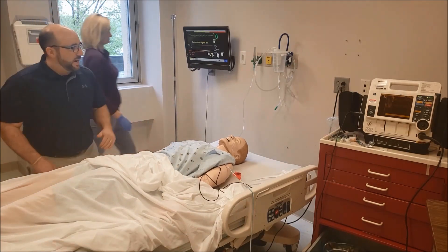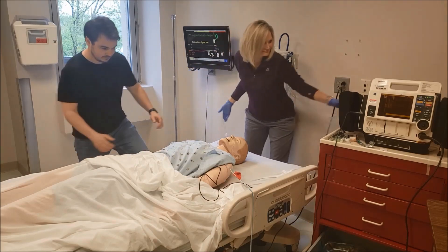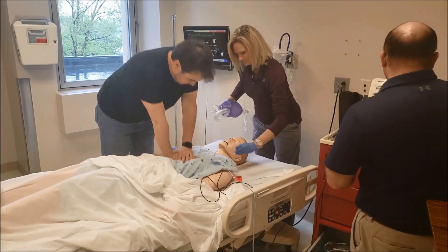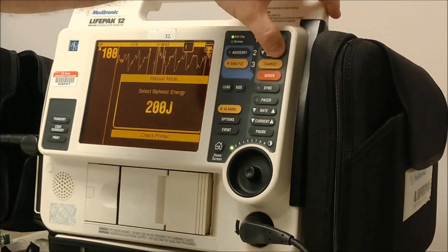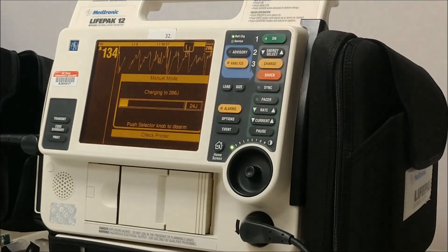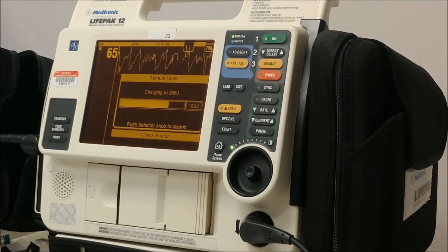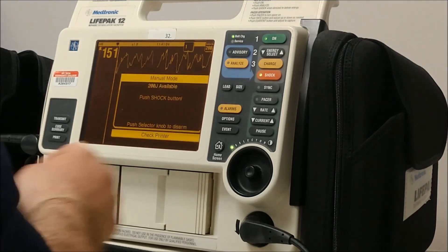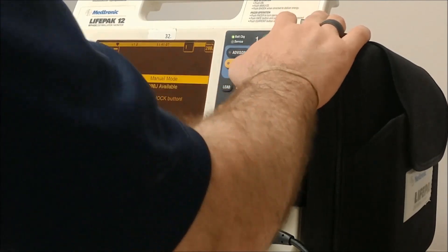Jeff, you're on chest compressions. Natalie, will you take the airway? I'm going to charge to 200 joules while they're doing CPR. With V-fib, we want a defibrillator. Let everybody clear the patient — I'm clear, you're clear, everybody's clear. Shock delivered.